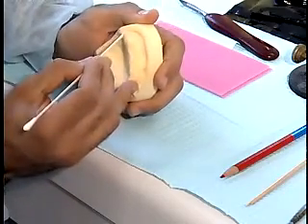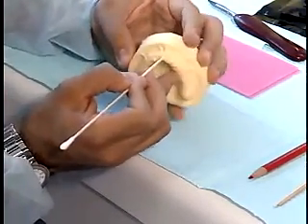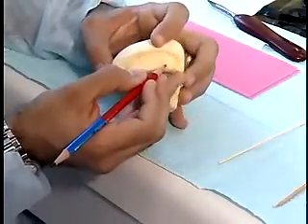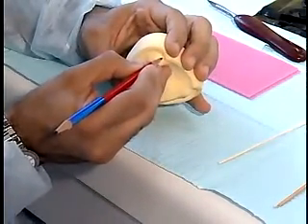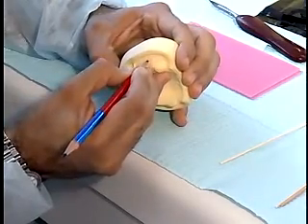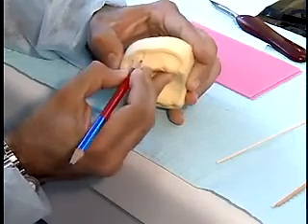Mark the outline of the tray starting at the pterygomaxillary notch. Make a red line 2 mm to the depth of the vestibule, or the blue line. Note that the tray will be made short to the vestibule by 2 mm. Continue the line to the opposite side.